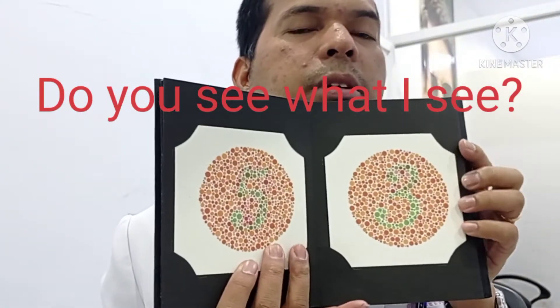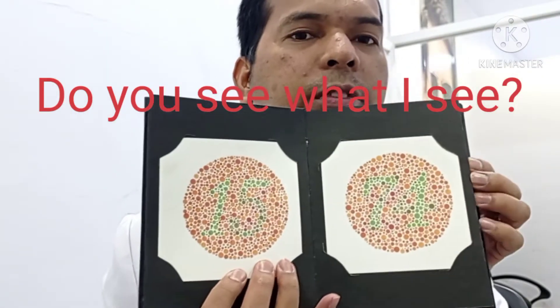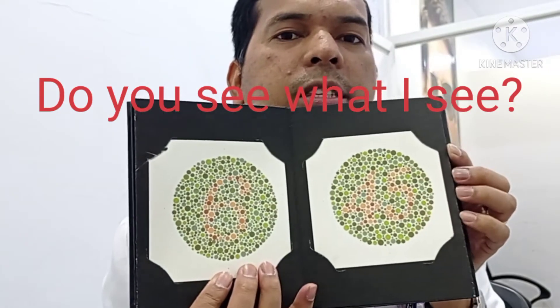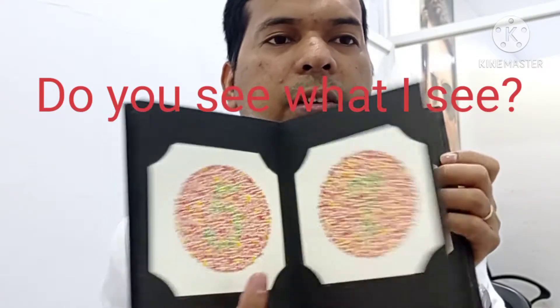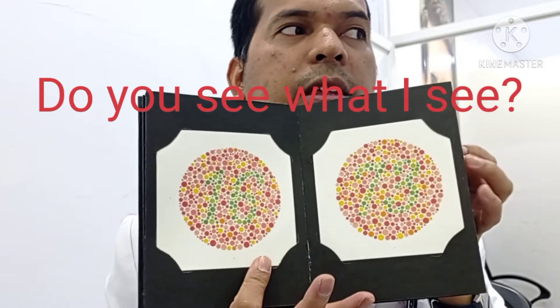The other one is number five, number three. This one — 15, number 74. And this one — six and three. And the other one is 45. Here is five. And this is seven, right? This one — 16 and 73, right?